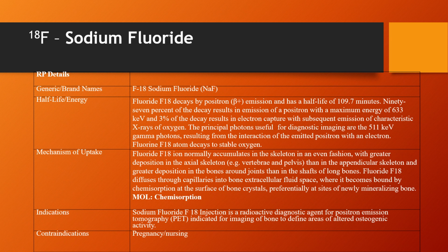Indications for sodium fluoride bone scanning are pretty much the same as any other bone scanning that you've already learned about. And we'll talk about that in a little bit also. There aren't any absolute contraindications for sodium fluoride studies. Pregnancy and nursing are listed there, but those are not absolute contraindications. Of course, the risks and benefits need to be weighed with the patient, and the patient needs to be able to make that decision along with her doctors and the ordering physicians.